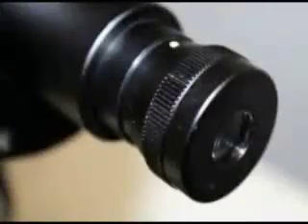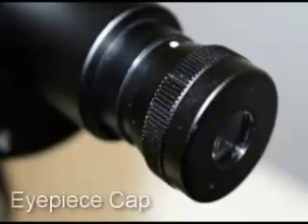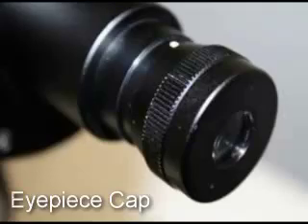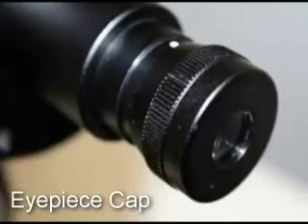Before taking a keratometry reading, the first thing that should be done is to focus the eyepiece. Position the white back occluder vertically in front of the instrument. Turn the eyepiece cap counterclockwise as far as possible. Looking into the eyepiece, turn it clockwise until the plus sign becomes sharp and in focus.